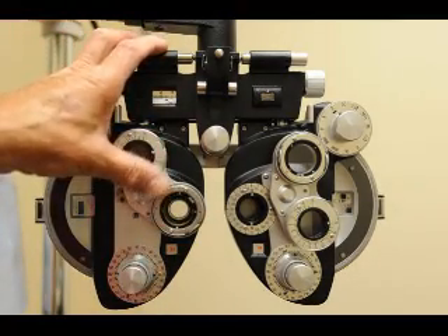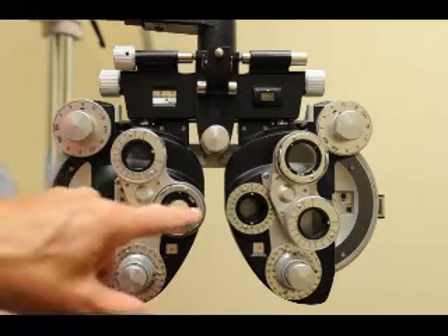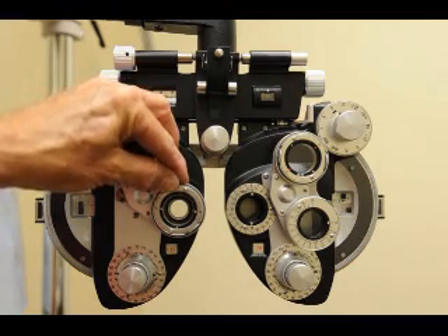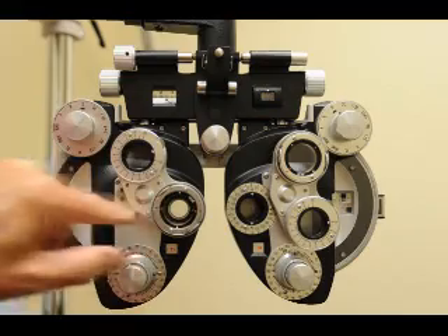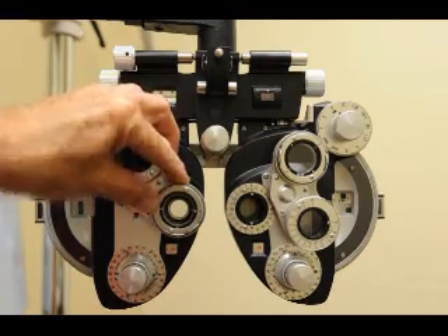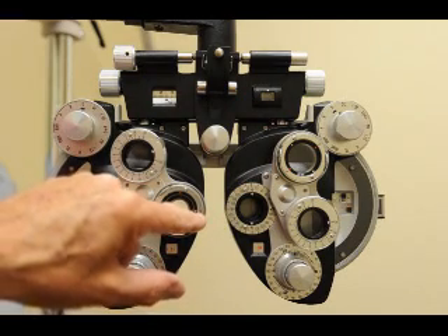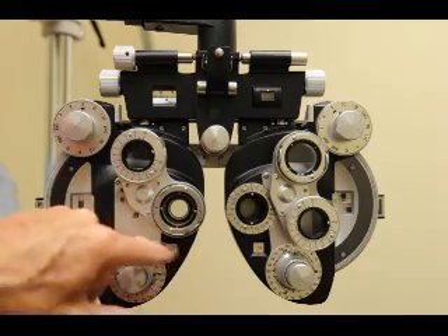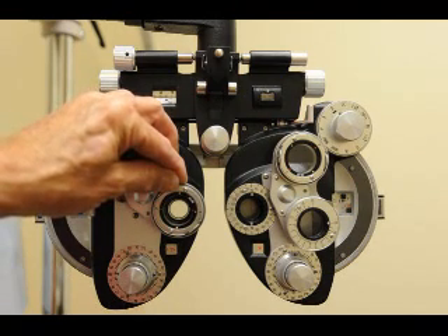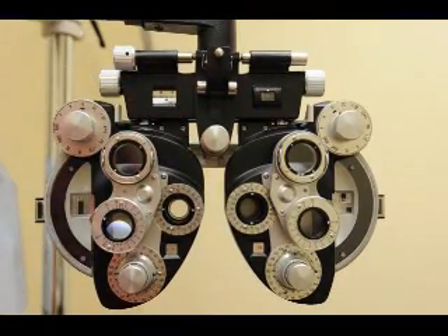Now line up the dots with the axis to check cylinder power. 'Better three or better four?' They say four — red is on the axis line, so you want to add minus. Give another quarter of minus. 'Better five or better six?' They say six, so add another quarter of minus. 'Better seven or better eight?' They say seven — they didn't want that, so take off a quarter of minus. 'Better one or two, or about the same?' About the same — you are finished with the cylinder.